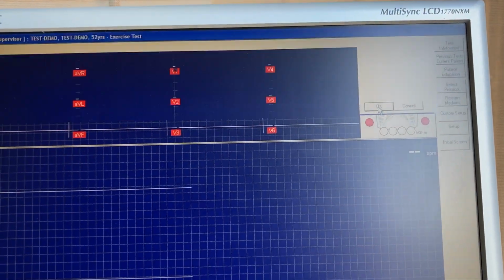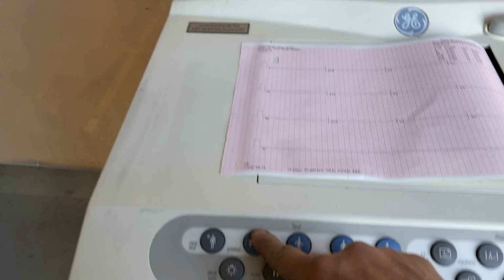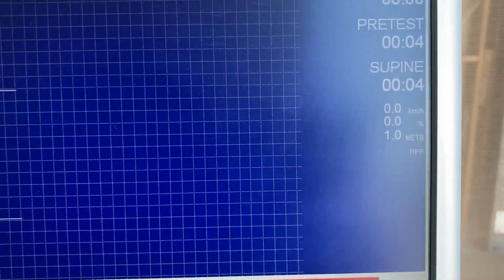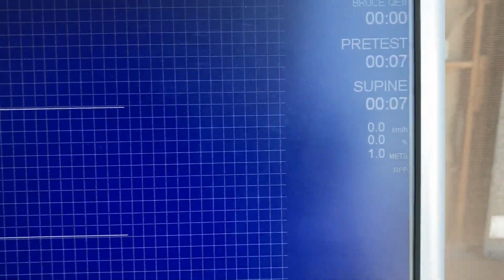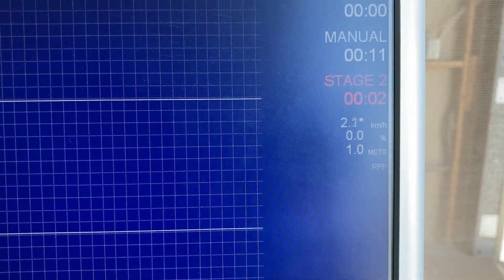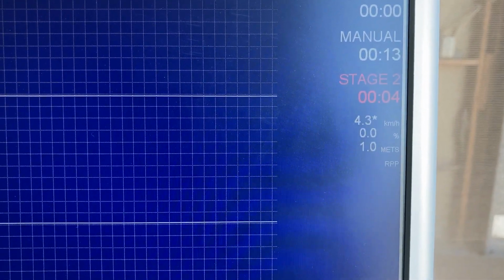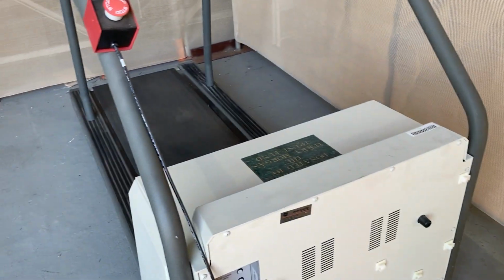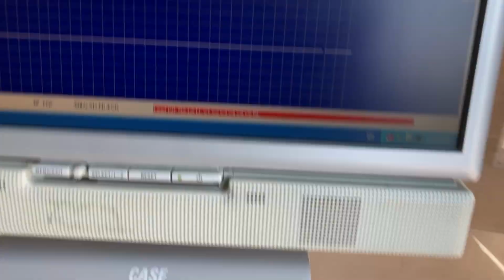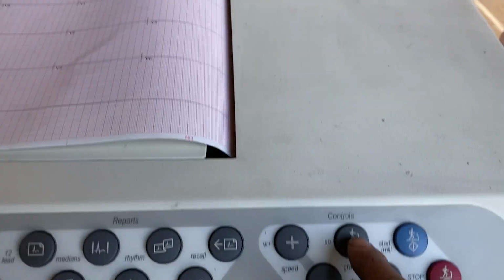Select the options and begin the exercise. Pre-test. Just gonna increase the speed. Also gonna increase the incline.